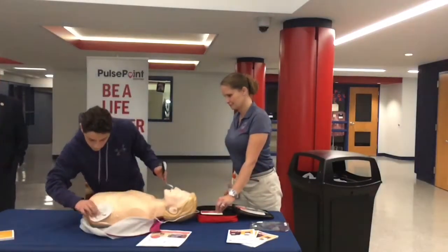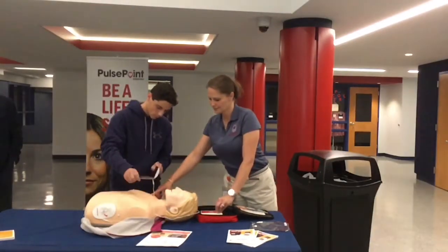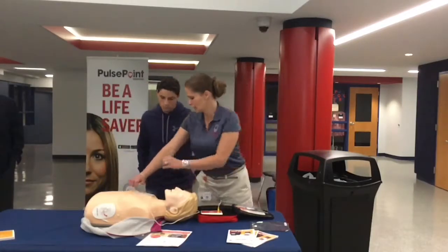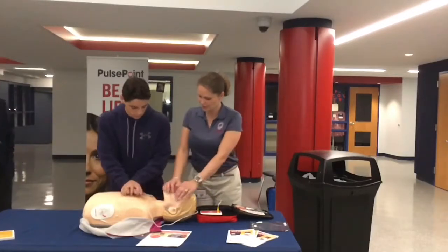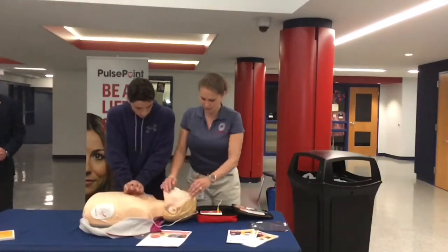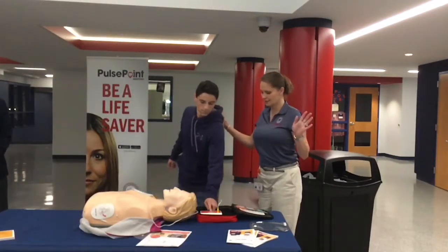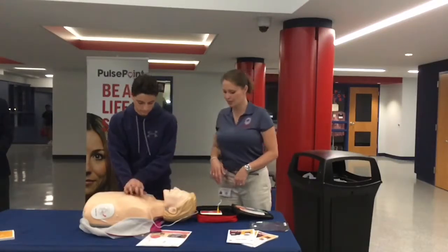Do not touch the patient. Shock advised. In the meantime, you can actually be calling out CPR if needed. Stay clear of patient. Deliver shock now — make sure everybody's clear. Shock delivered. And the very next step is to continue CPR. Begin CPR.